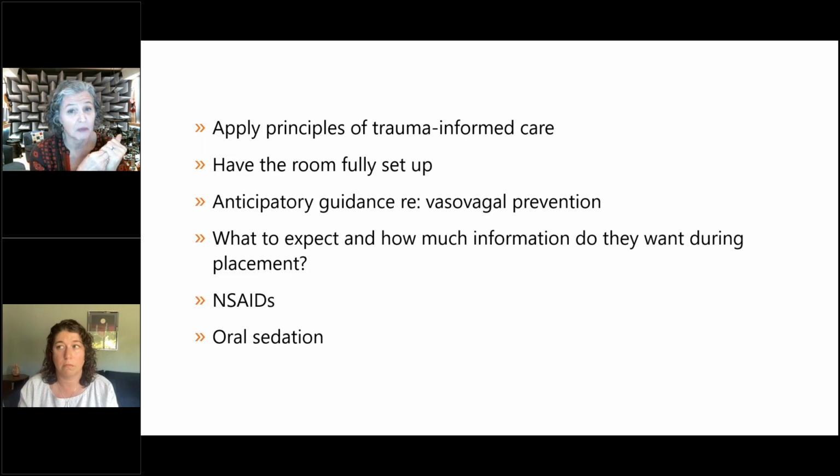Having the room fully set up, critically important. We're going to talk about anticipatory guidance about vasovagal prevention, what to expect, how much information does somebody want, what kind of communication are they interested in during the placement, both before and also during the placement. Do they want to just be told what's going to happen next, in terms of you might feel something cold now, or would they like to hear something more specific, or would they like not to talk about it at all? We are going to talk about NSAIDs and oral sedation as well.